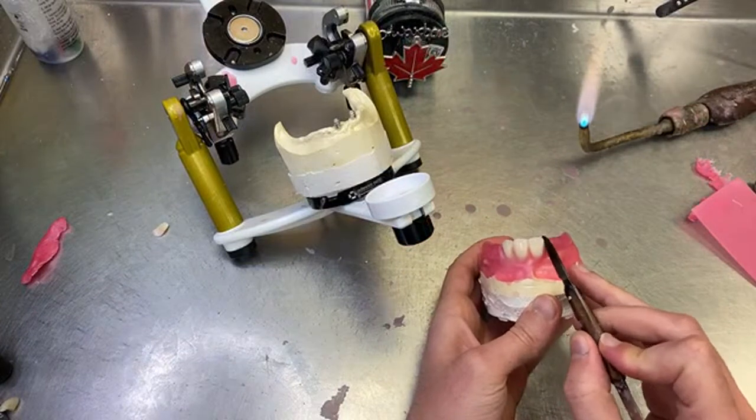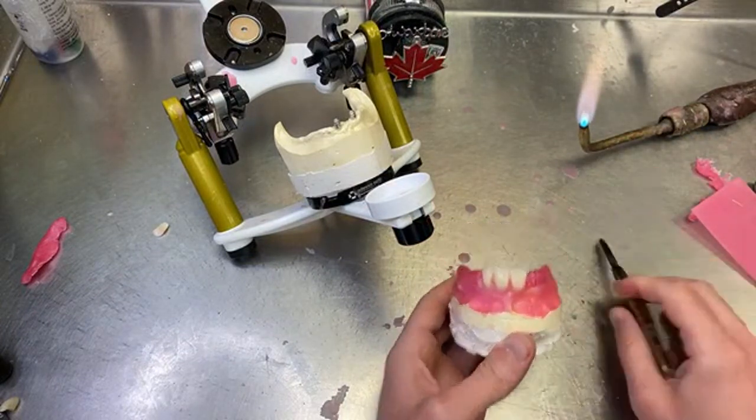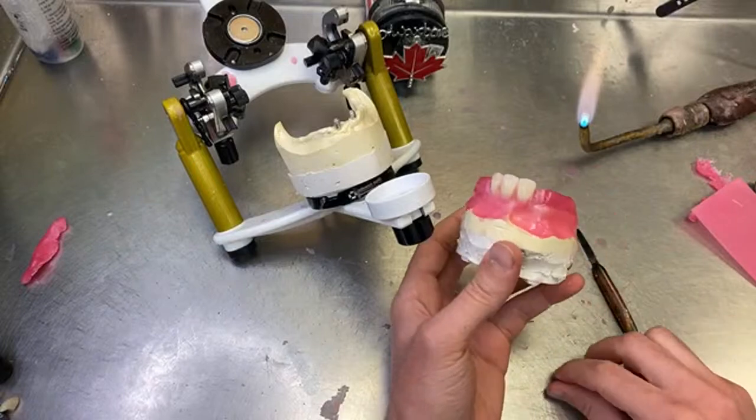My problem is the left side, because I'm right-handed, so I like to work upside down when it's the left side.